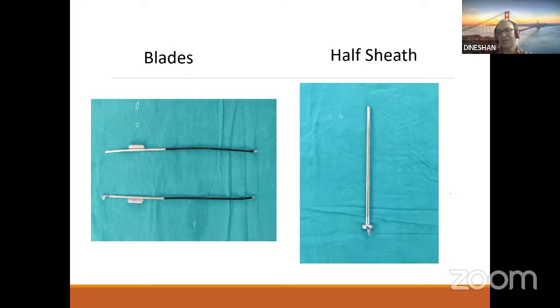The complication of internal urethrotomy is that if you don't do it in the 12 o'clock position, and it is slightly going by the side, you can injure the dorsal vessels, arteries and veins, and cause profuse bleeding. And sometimes if you simultaneously injure the corporal bodies, rarely the patient can develop a high flow priapism.